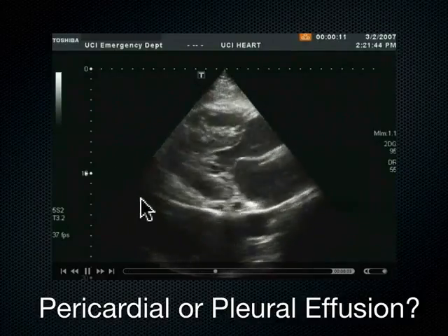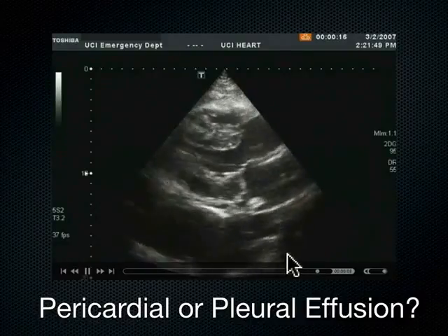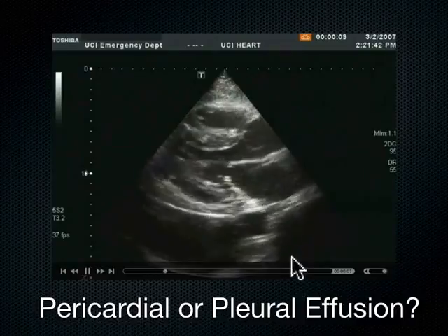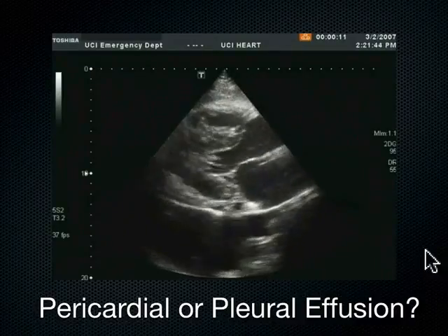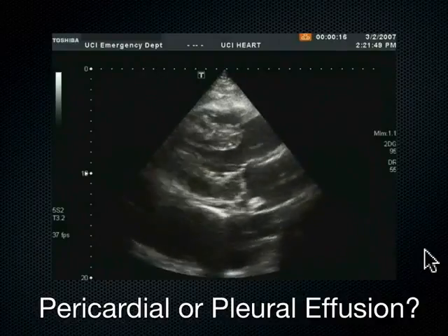The answer is yes. This is posterior to the descending aorta. This fluid comes along, as Dr. Landorf is saying here, posterior to the descending aorta, and therefore, this is a pleural effusion. Confusing. I agree. It looks just like a pericardial effusion.